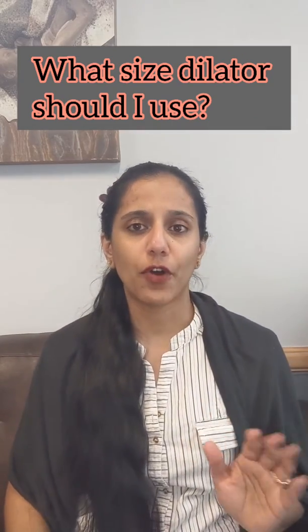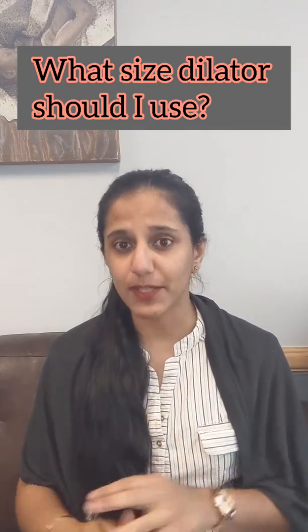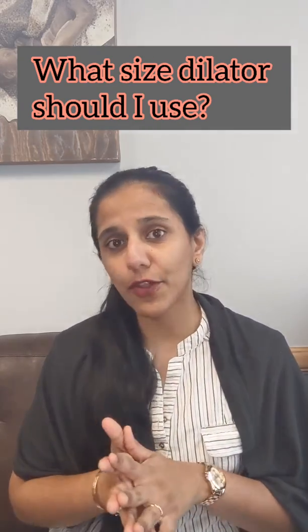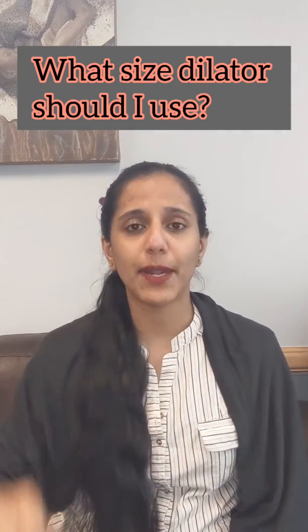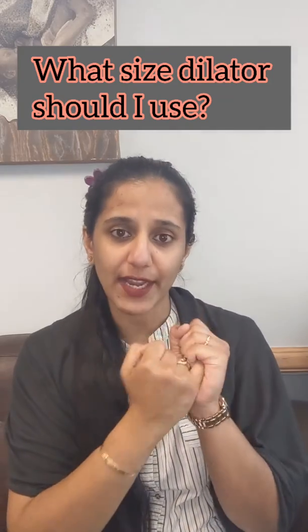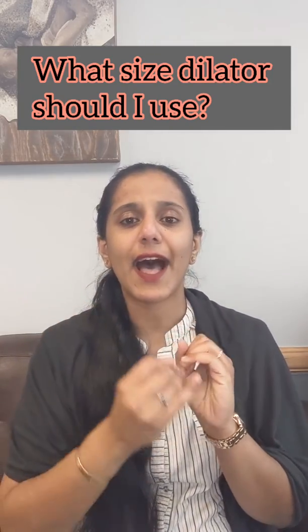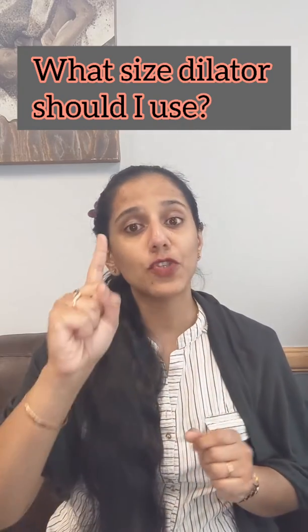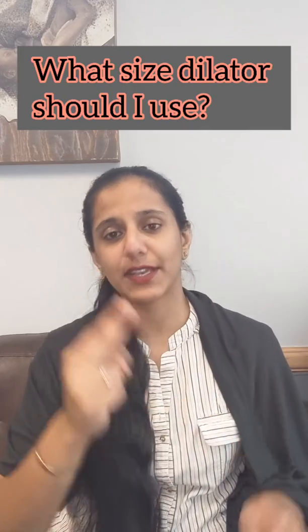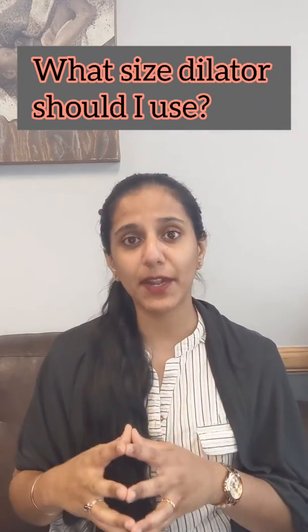So, first of all, you may want to work with an OBGYN or pelvic floor therapist, pelvic floor therapist preferably, to identify which size is right for you. Otherwise, you can just estimate by using a finger. Start with the pinky, insert it into the vagina, and if that is comfortable, then add in another finger. Then use your index finger, and if that is comfortable, then you would use 2 fingers.